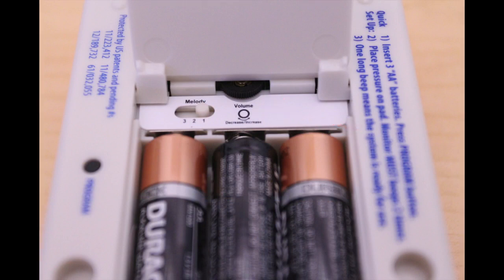Choose from three alert sounds: one, Somewhere Over the Rainbow; two, You Are My Sunshine; or three, standard alarm.